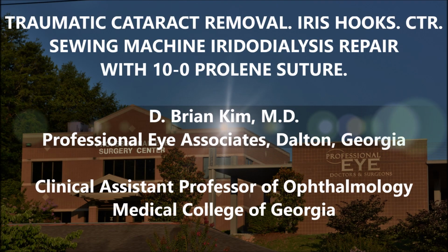I want to share with you this case of a patient who was referred for a traumatic cataract. This patient also had about 3 clock hours of an iridodialysis. So you're going to see how I removed this traumatic cataract. There are areas of loose zonules in that area of the iridodialysis as well.